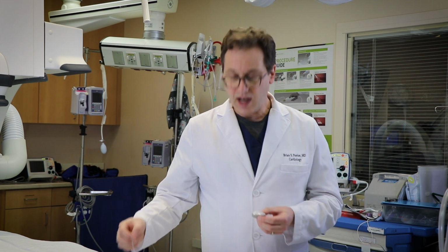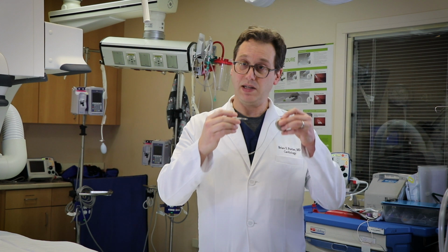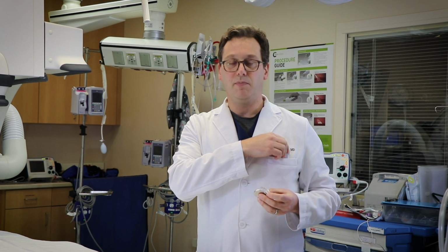The cardiac pacemaker has a special wire that runs down inside your body from the pacemaker down to your heart. And that's how the pacemaker knows what is going on with your heartbeat. For someone whose heart rate is too slow or whose heart's electrical system is beating unreliably, the pacemaker can detect that through this wire. And then the pacemaker can deliver a pulse down to the heart to tell the heart to start beating again. So this is a very useful procedure that we will offer to patients whose hearts are beating too slowly or in an unreliable way, potentially causing them to faint or to feel badly because of a low heartbeat. And pacemakers come in all different shapes and sizes. There are a number of different companies, but in general, they're all pretty small devices that fit in the upper chest area.